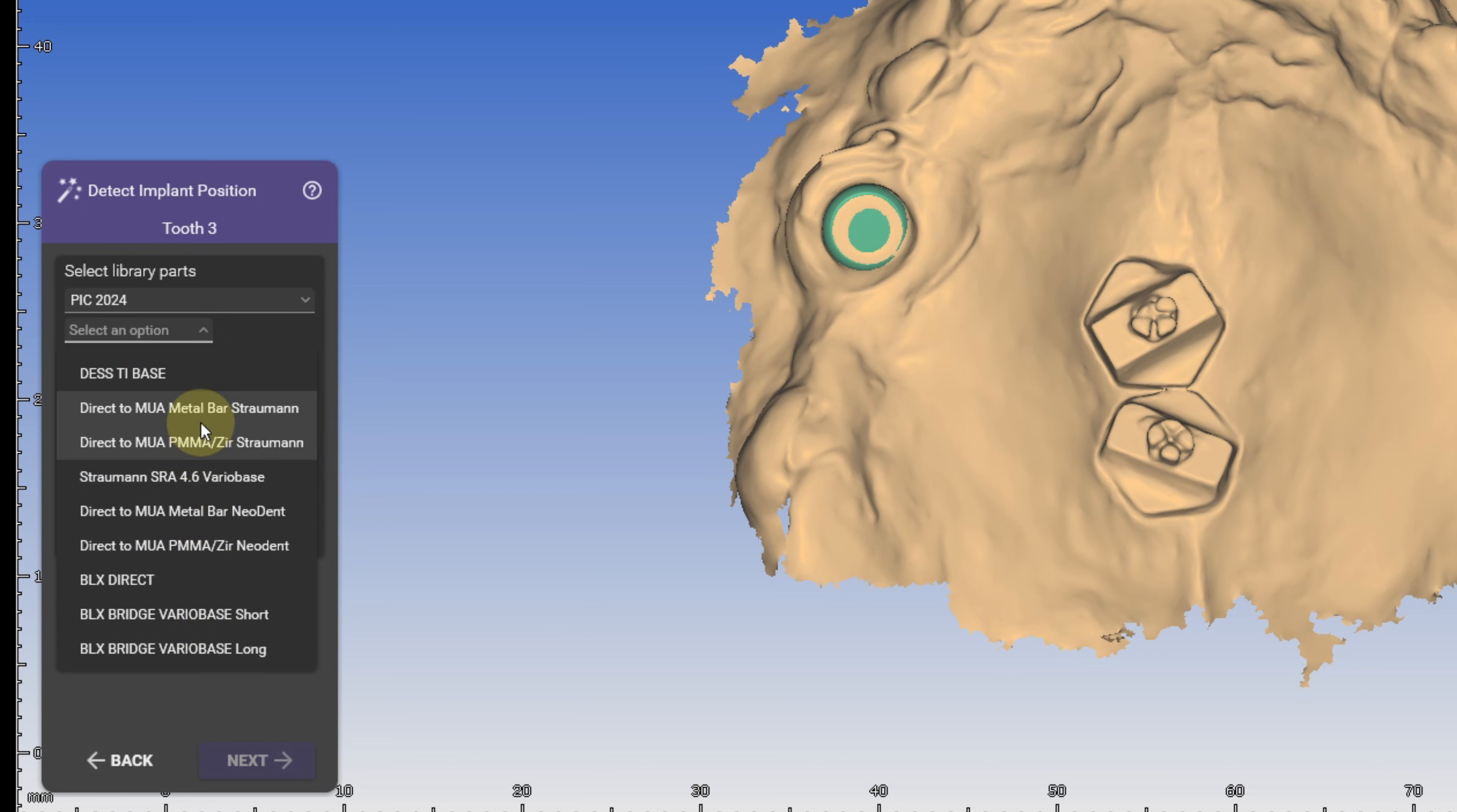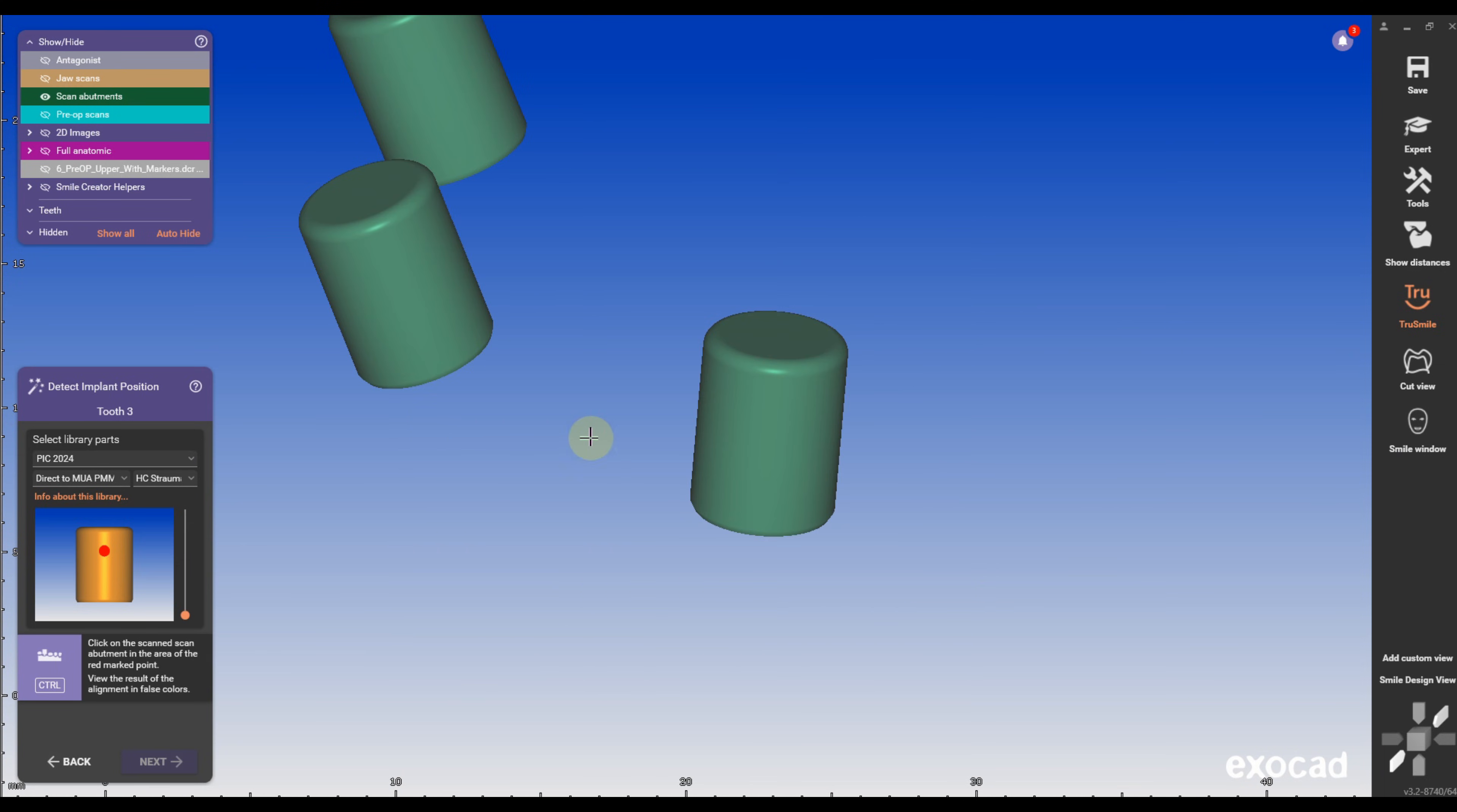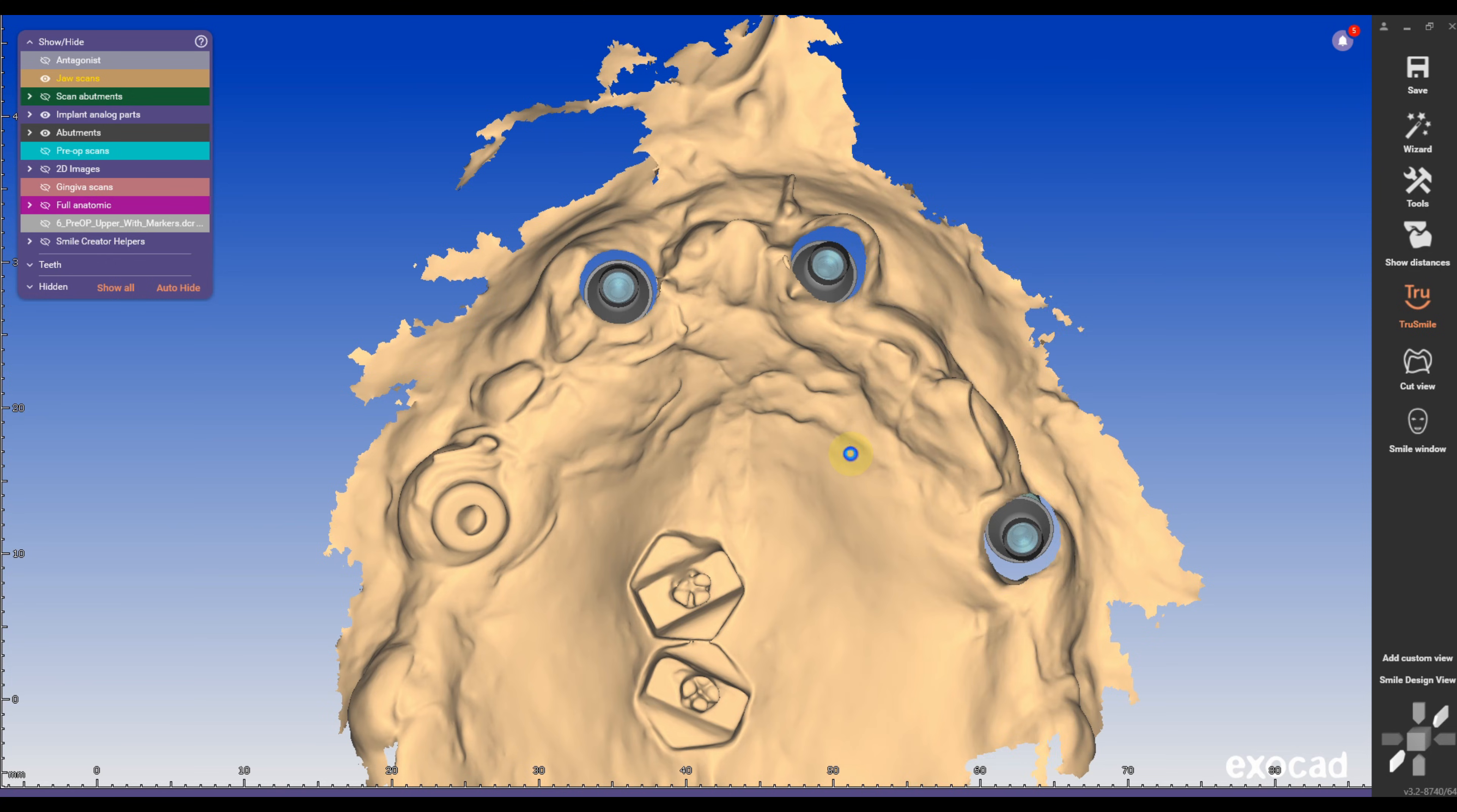In this case, we are using a PIC scanner, and the team from PIC will provide you with all the necessary libraries. This case involves Straumann implants, so I am using the direct-to-multi-unit PMMA selection and align the library to the PIC STL. Avoid using the IOS scan file as your scan abutment file, since it will be highly inaccurate.